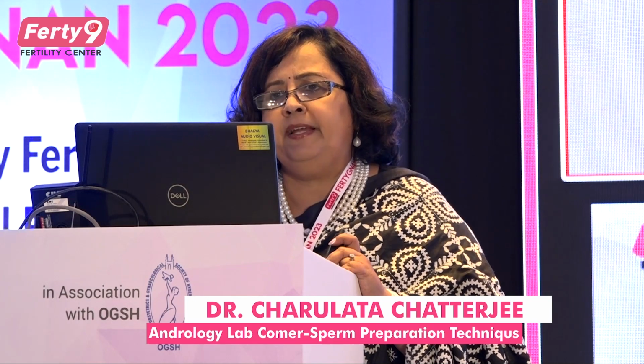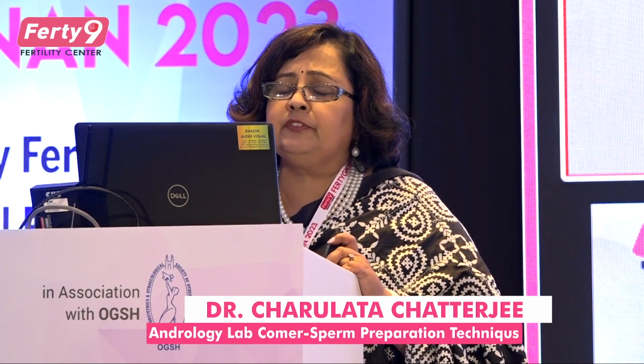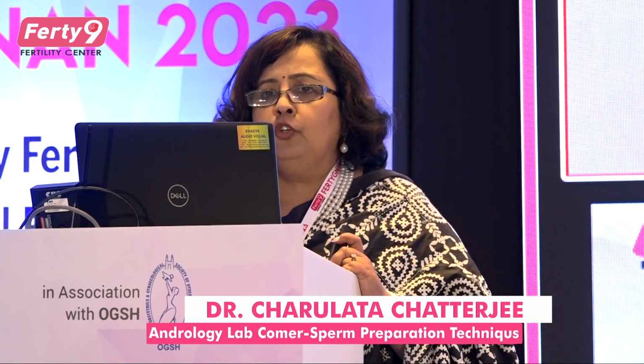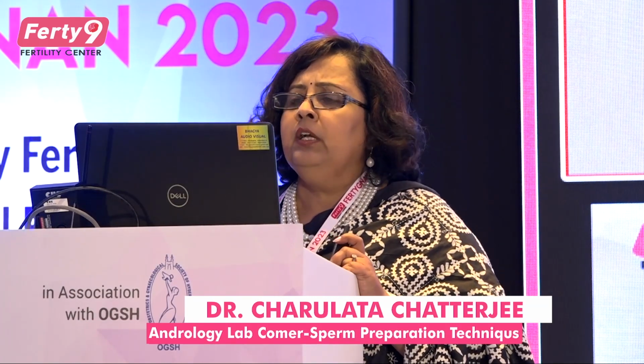There is another technique, microfluidics. This technique is based on sperm motility. With this microfluidics, the outcome is of so little volume that it can be used only for ICSI. It cannot be used for IUI, or sometimes even for conventional IVF. The most popular method these days is microfluidics by a technique called Zymot.